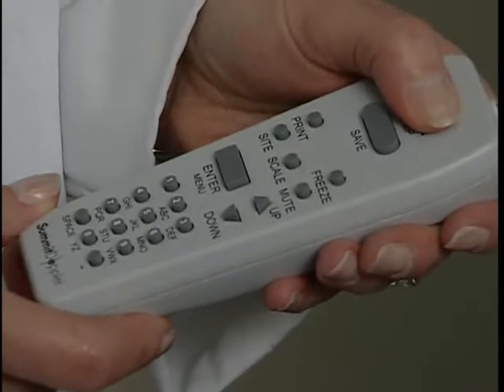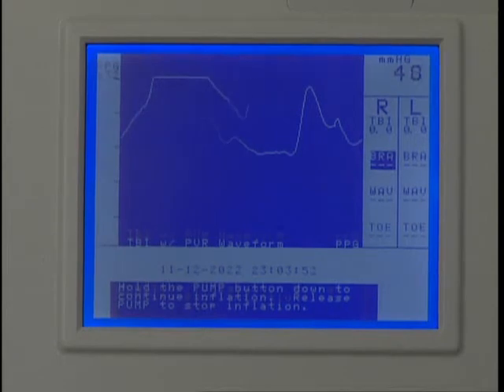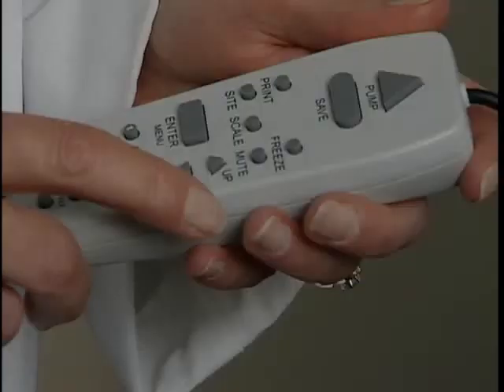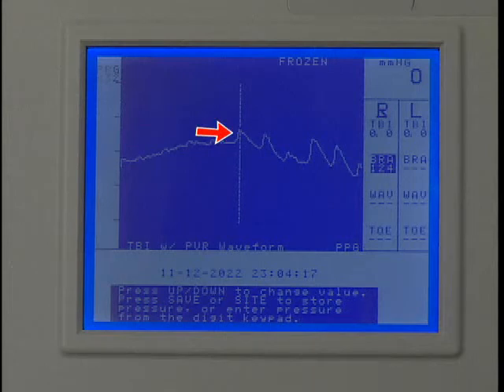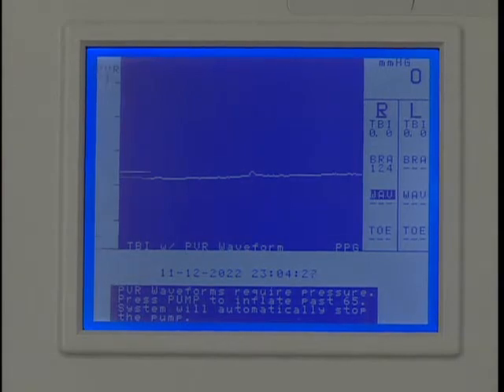Once stable, press Pump to inflate the cuff. Continue to inflate to a pressure approximately 20 millimeters of mercury above the pressure where the PPG pulsations disappear. The cuff will begin to deflate automatically once the pump stops. Press Freeze after several pulses have reappeared. Press the up or down key to move the caliper tool to the beginning of the first upward slope at the start of the pulsation as shown. This is the systolic pressure. Press Save to record it and the marker will move to the next protocol location.